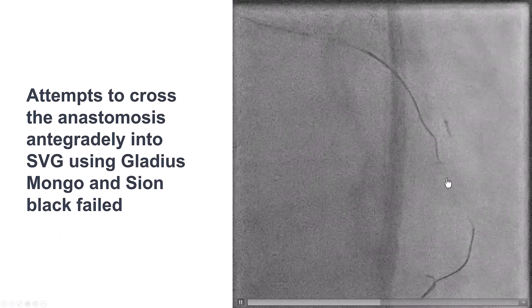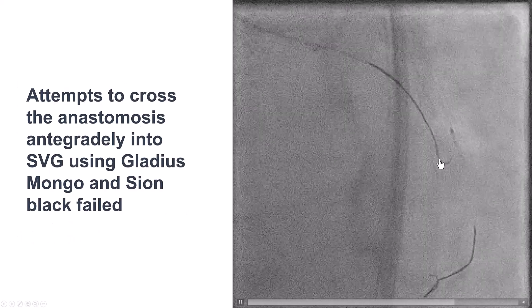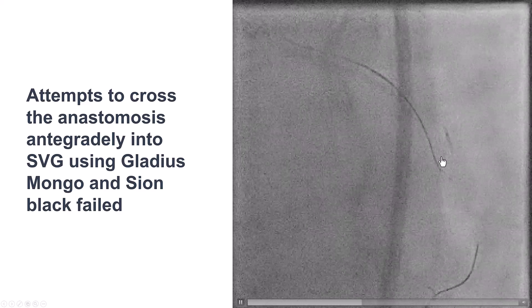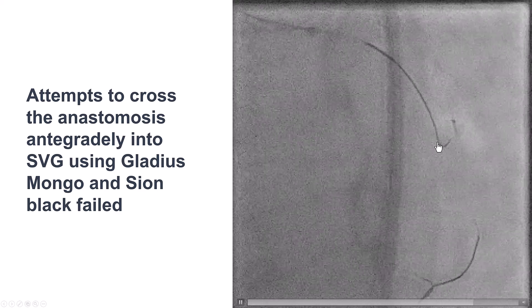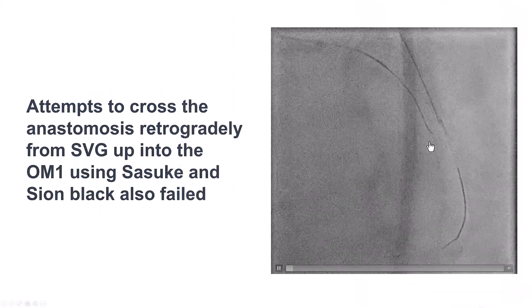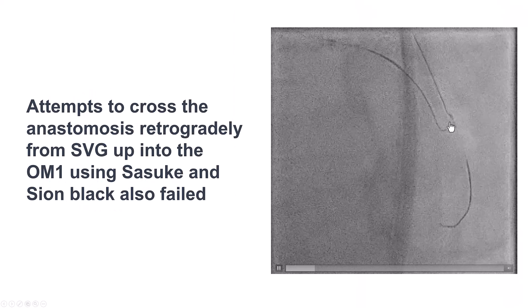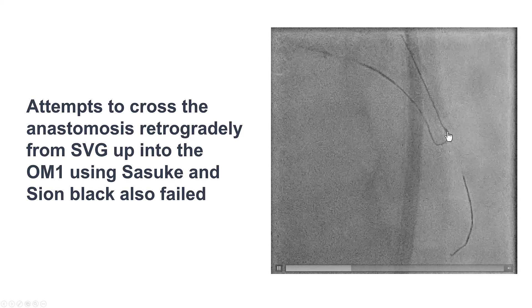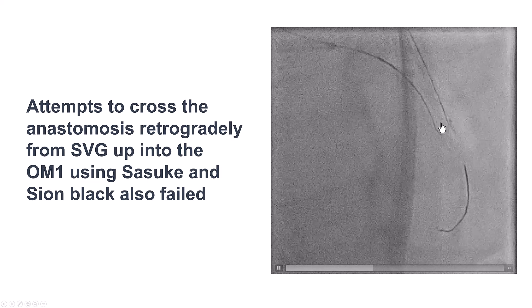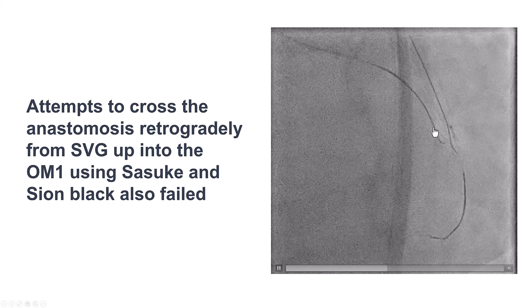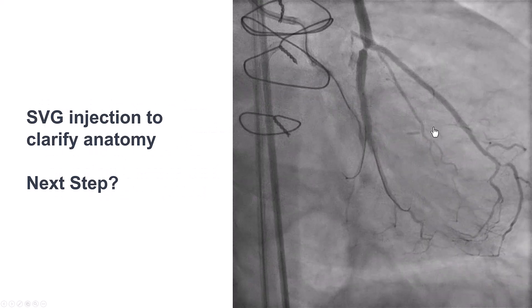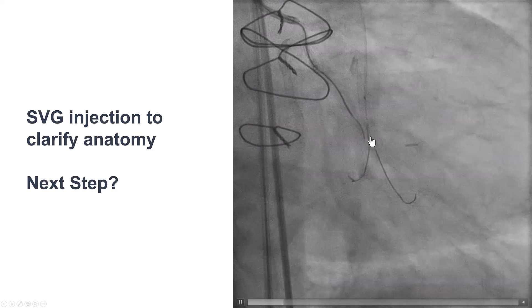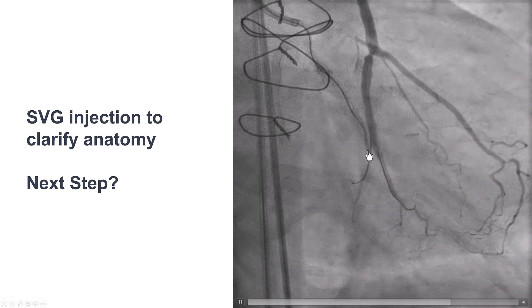We made multiple attempts to advance an antegrade wire into the distal OM1, but unfortunately the angulation was extreme and we could not advance the guidewire. We also tried to advance a guidewire retrograde using a Sasuki dual-lumen microcatheter and Sion Black wire, but once again had a lot of difficulty navigating through this extreme angulation. We were very close, but could not advance either an antegrade or retrograde wire into this portion of the vessel.